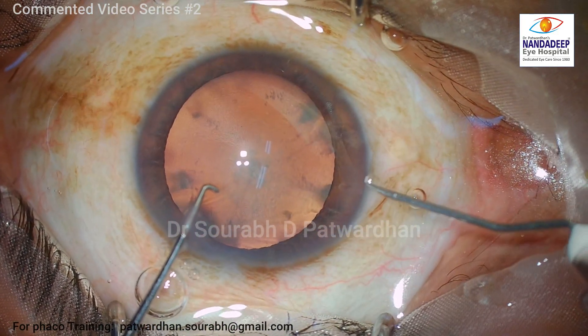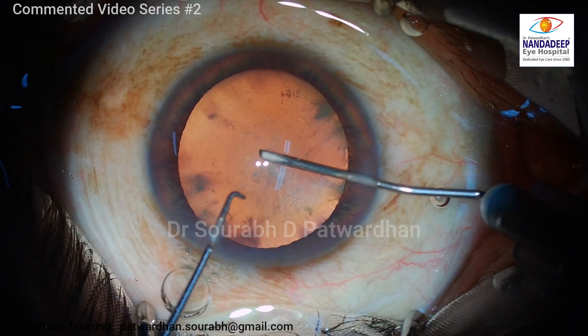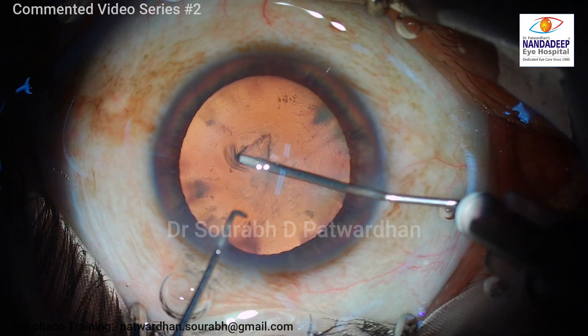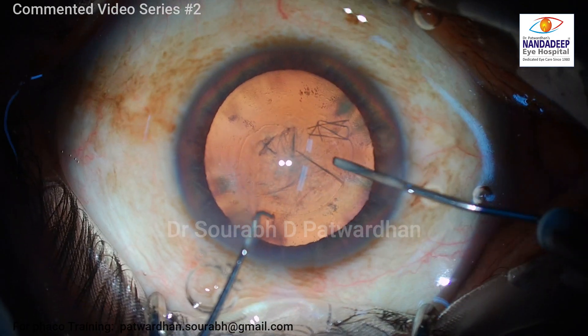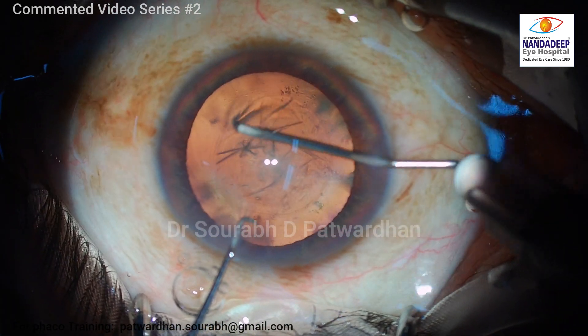I noticed it in our biometry — I generally use the IOLMaster 700. We have to keep in mind these biometric changes in each and every case. Sometimes patients have very deep or very shallow anterior chamber depth, and in this case it is a very thin crystalline lens. Let's see how I proceed.